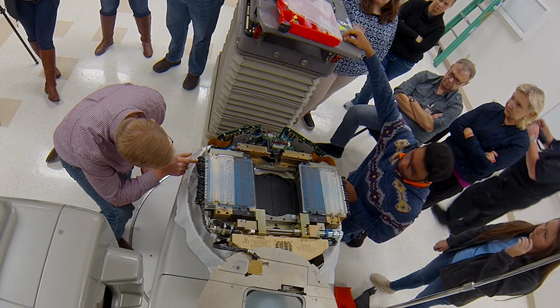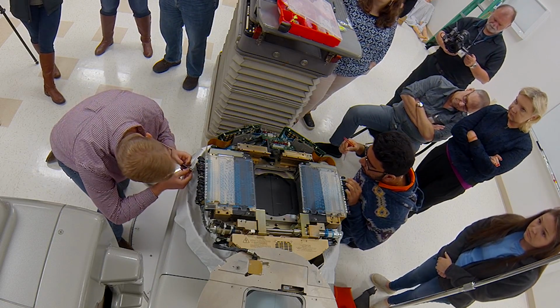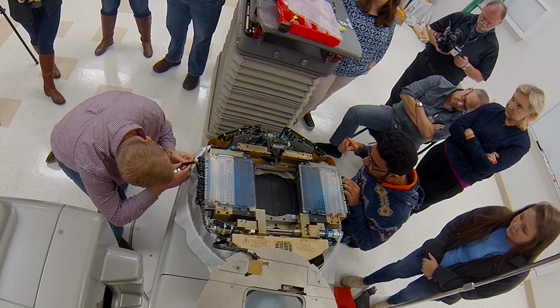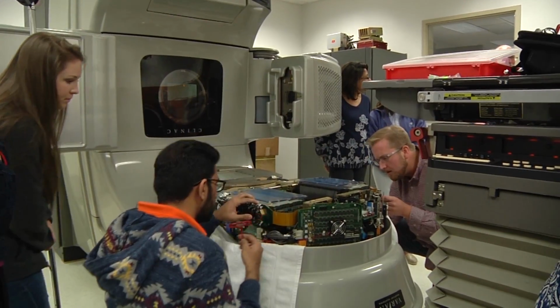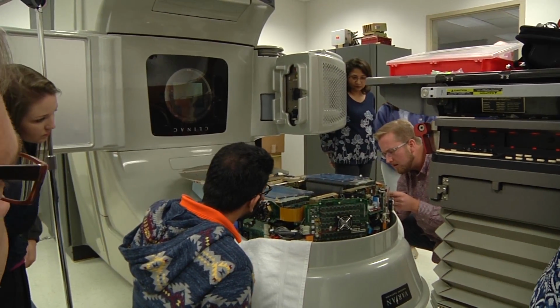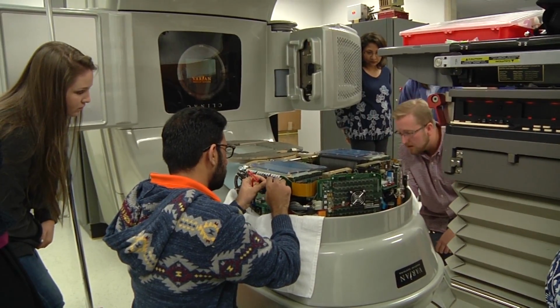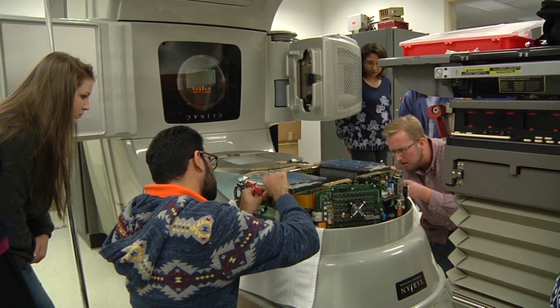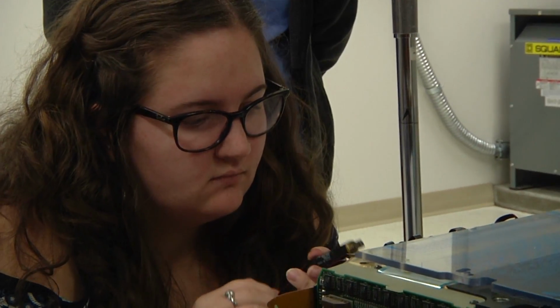And one thing you want to be careful with the motors, they don't work so well after you drop them. So if you drop a motor, I would still stick it in and see if it worked. But just keep that in mind. Don't drop the motors.